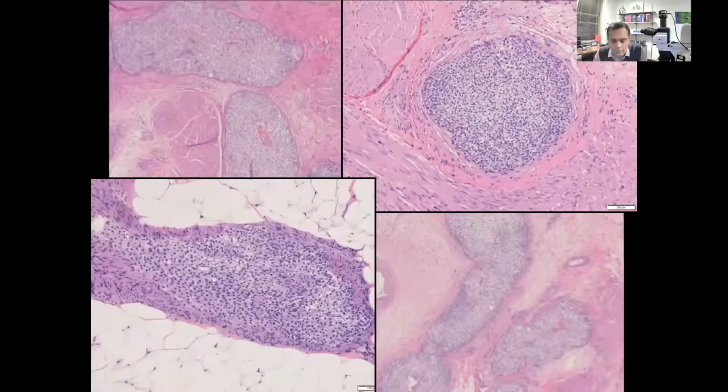In fact, these tumors, despite the bland cytology, often tend to present in a high stage. In this case, you can see there is a vessel in the perivesical adipose tissue that's being invaded by this large nested variant of urothelial carcinoma, again with bland cytology.